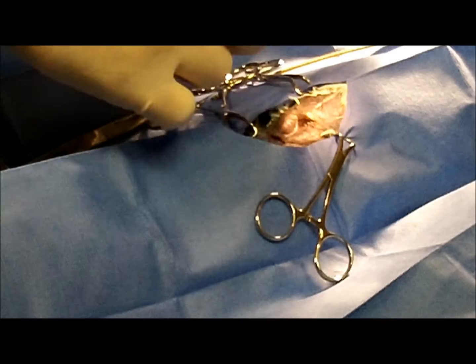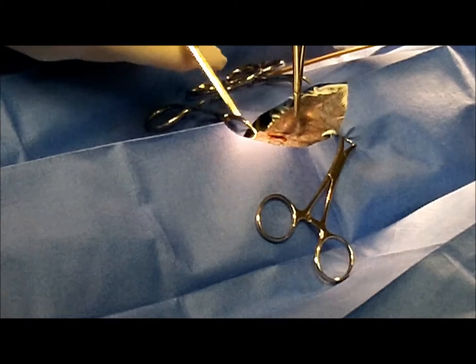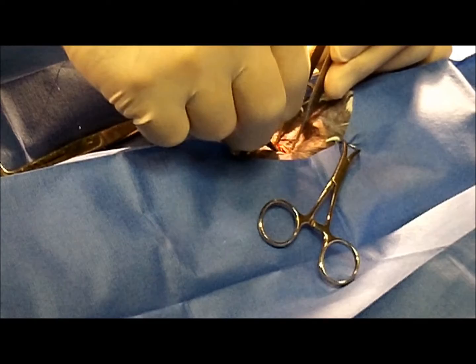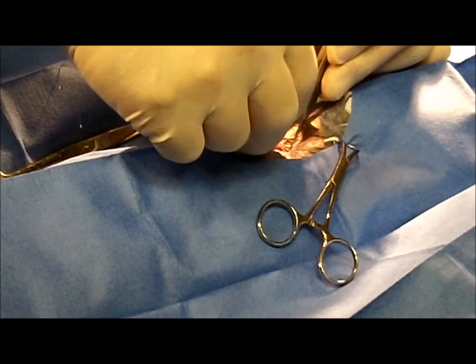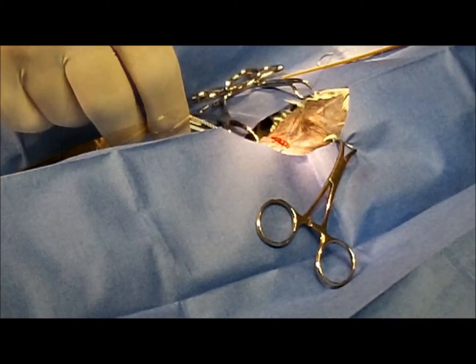Then what we're going to do is scarify — we're going to remove a little bit of the fat from the edge of the cloaca so that it adheres. Here I am taking the edge of a pair of scissors and scarifying the tissue so it'll adhere, because we want it to adhere to the abdomen so that it doesn't pop back out and doesn't prolapse again.